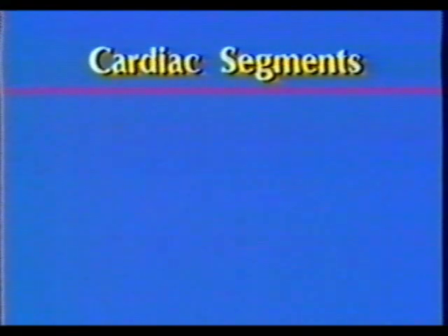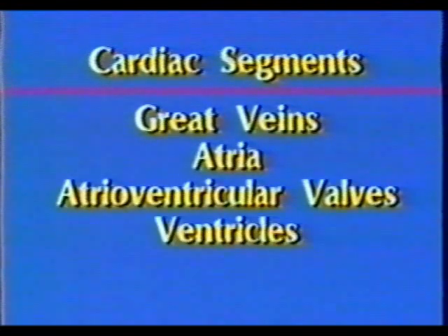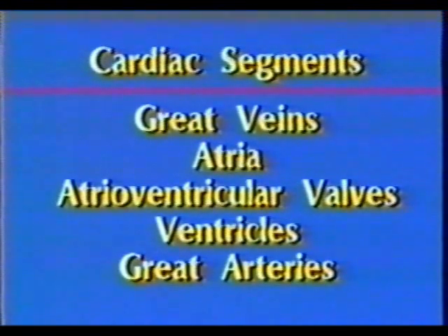Having defined the visceral situs, we now proceed with the rest of the examination following a segmental approach. Segmental approach is based upon building blocks concept and is defined as following a sequence of examinations based on anatomic connections. We start with the great veins and follow the flow of blood through the atria into the ventricles and into the great arteries. The challenge is to accurately identify all of these building blocks in order to arrive at an accurate anatomic diagnosis.